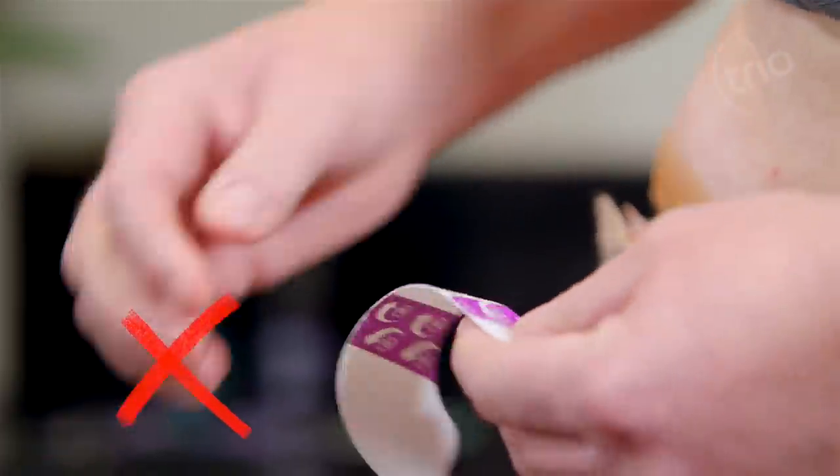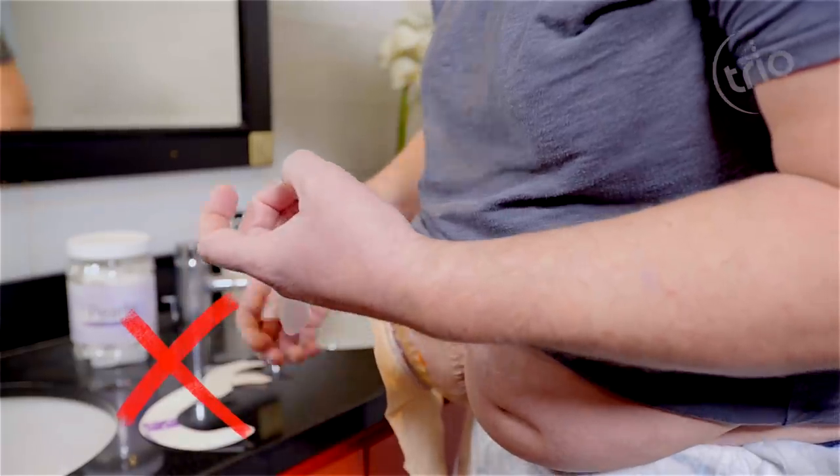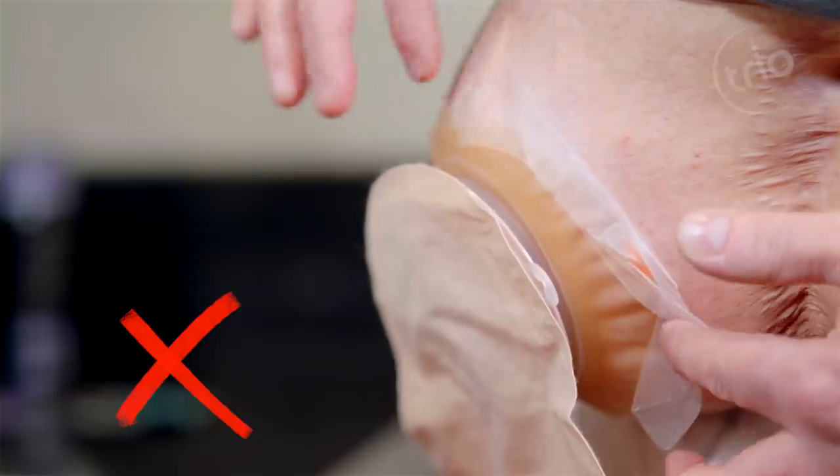Do not release the release liners first, as the Silics Flange will not attach firmly to the skin around the bag.